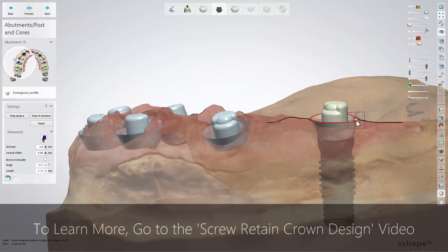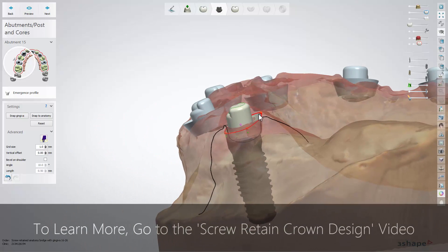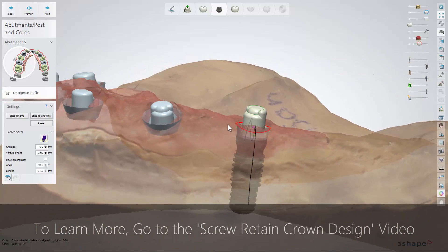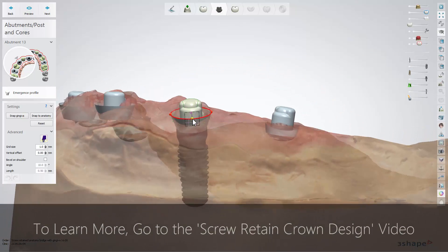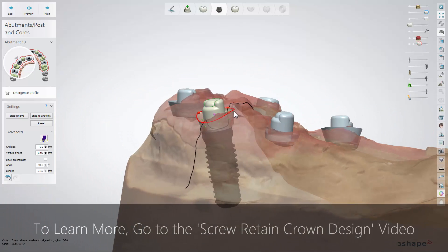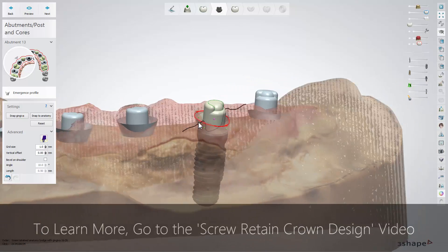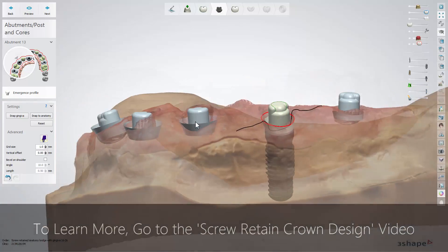At this design stage you can shape the emergence profiles of each bridge abutment. It is easily done on the translucent models due to the visible contour lines. Start with positioning the control points of the emergence profile at the required level in relation to the gum edge, usually about 1mm below the gingiva level. When activated, the points show the grid mesh, which helps you to measure distances.